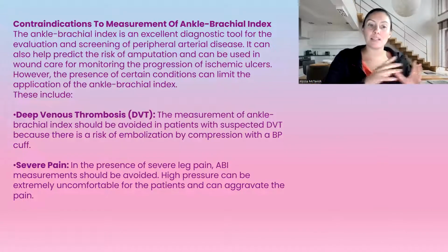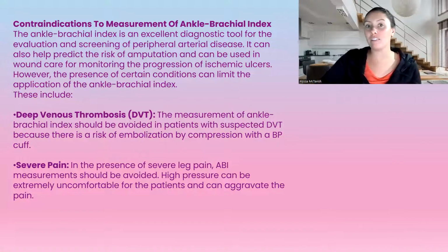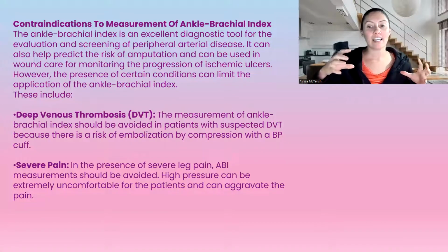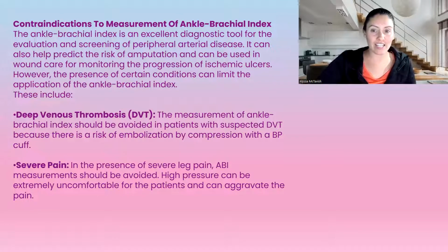Okay, if somebody has severe pain in their legs, don't attempt to do this. Okay, it is going to cause them so much pain. So if somebody's already having throbbing pain in their legs constantly, if we go to compress their legs, it's just going to be such an aggravating pain for them. We should not be doing that.